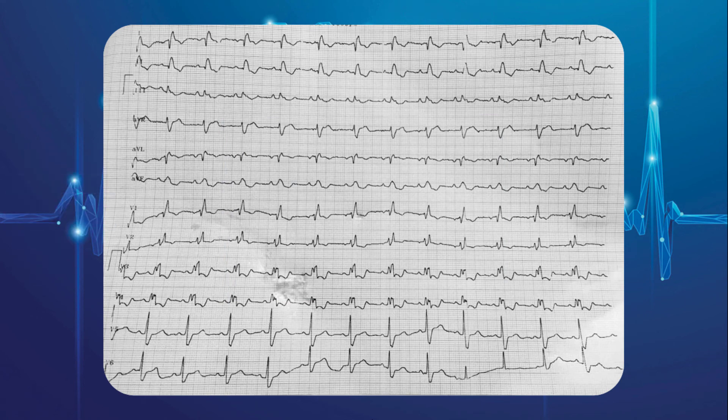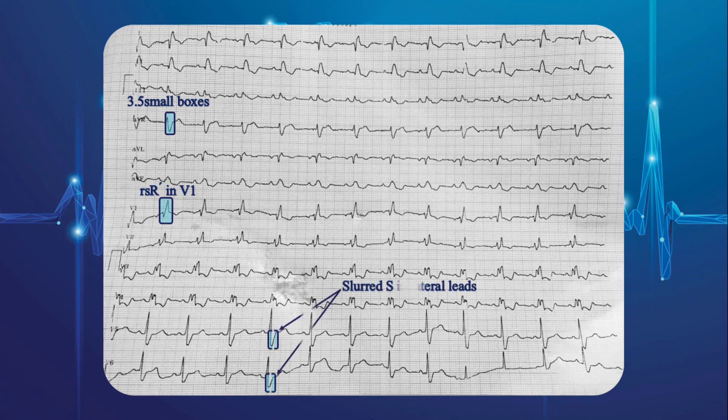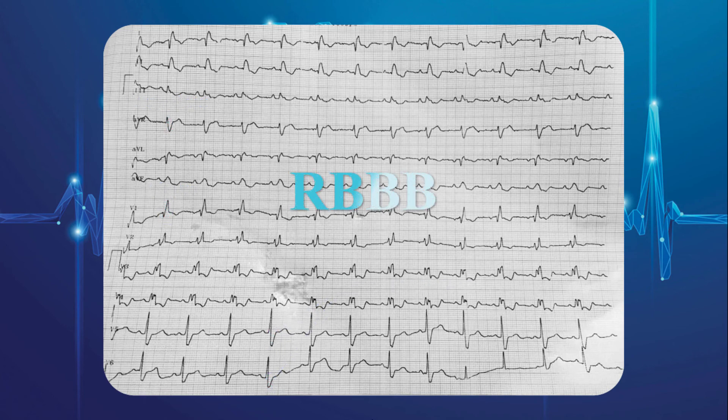QRS complexes are 3.5 small boxes in duration. On the other hand, there is RSR prime pattern in V1, with prominent slurred S in lateral leads. So QRS complex changes are due to right bundle branch block.